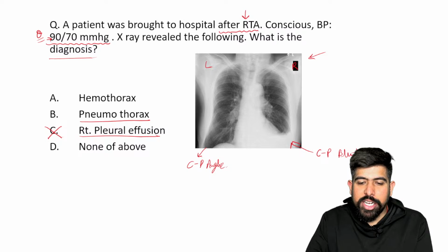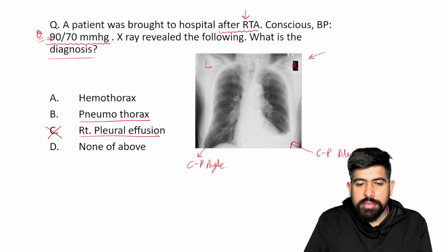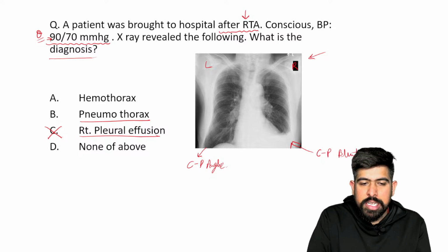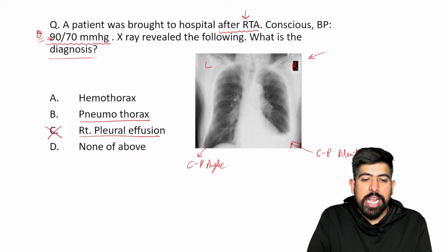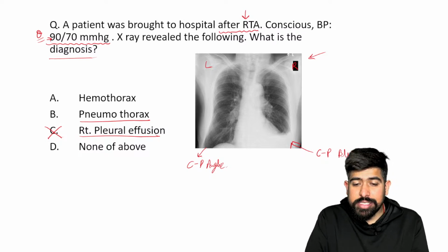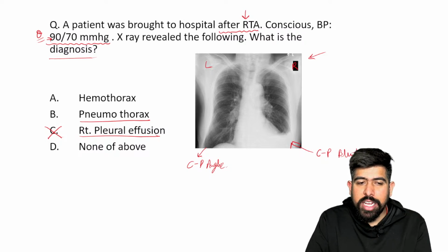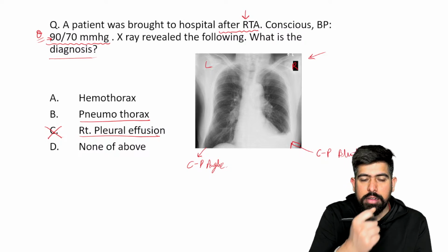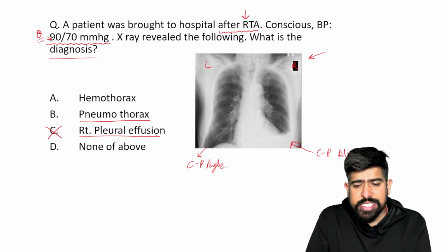So what you guys do on the exam day is you just see the X-ray and answer right pleural effusion. You didn't read the MCQ. This is the trick of the examiner who makes the MCQs, and they give you such clinical stages there.